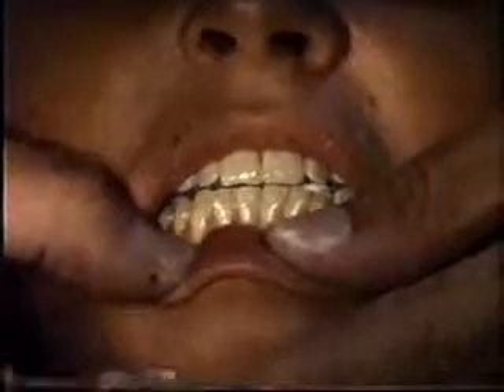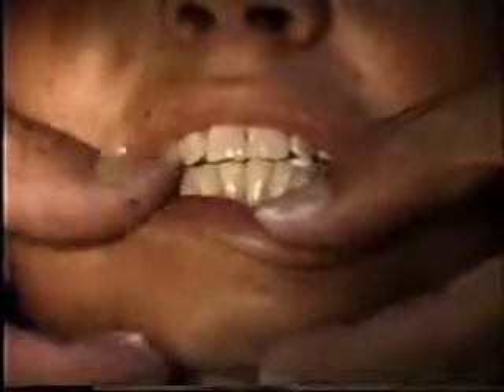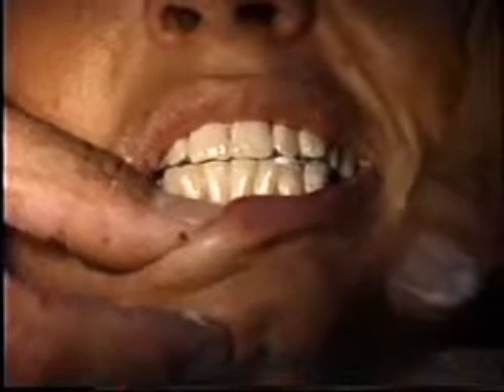Now we have added soft acrylic in the two areas — the bicuspid pads — and then we will replace the appliance and have her close into this new position using the ramp as guidance. Now come forward and hold that position, stay right there, and we also make sure the midlines are lined up.